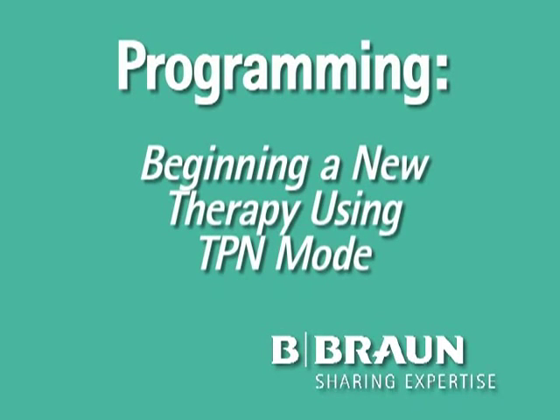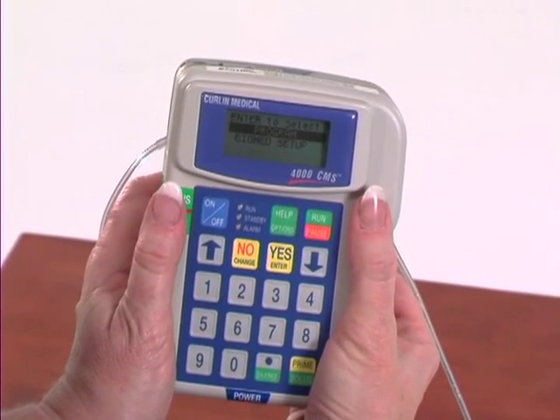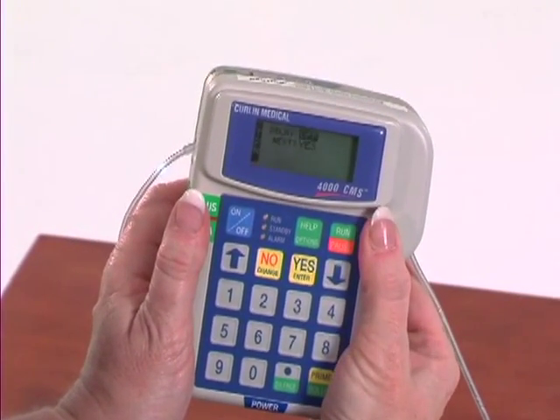If your pump has been set up to deliver total parenteral nutrition infusions when administering TPN therapy, this is how you would create a new program for the TPN mode. With the program line highlighted, press the Yes Enter button to begin programming a TPN therapy.